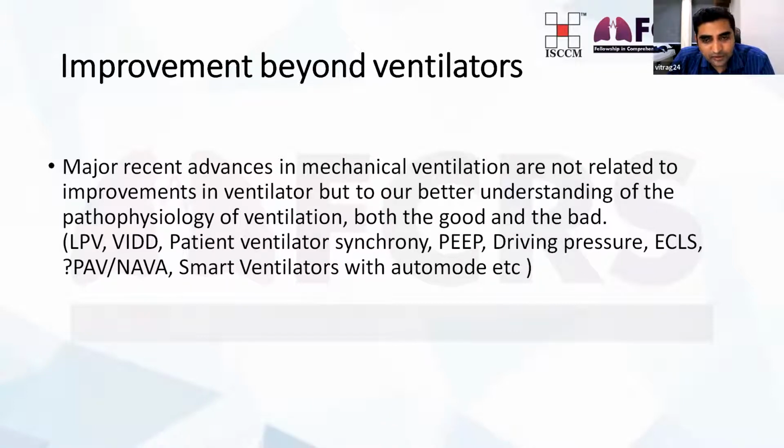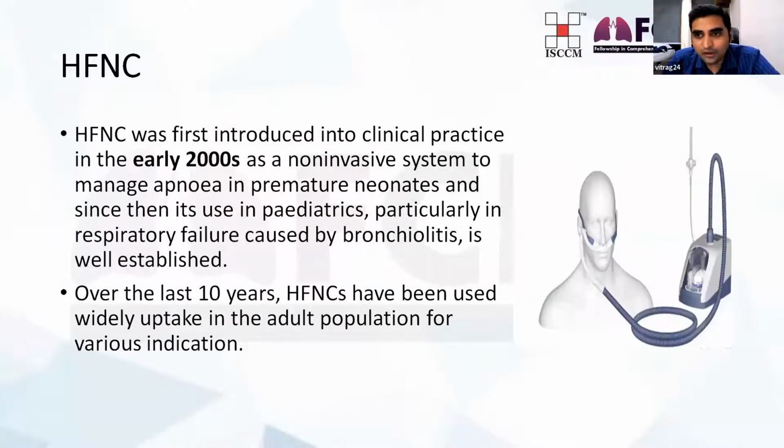So lung protective ventilation, ventilator-induced diaphragmatic dysfunction, patient-ventilator synchrony, use of positive end-expiratory pressure (PEEP), role of driving pressure, extracorporeal life support, that is ECMO and extracorporeal CO2 removal, proportional assist ventilation, NAVA, and smart ventilators with auto mode. Many things have been developed.